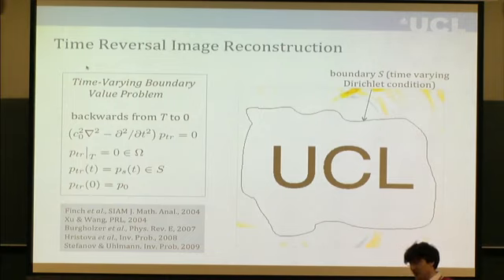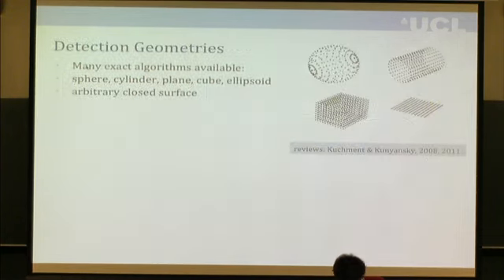What you do is when you start off the reconstruction, you don't start off with zero. You take your final time points and you calculate the harmonic extension from those time points into the domain, and use that as your starting point. And you can iteratively form a Neumann series which will converge to the right solution. So I'll come back to that later actually as well.